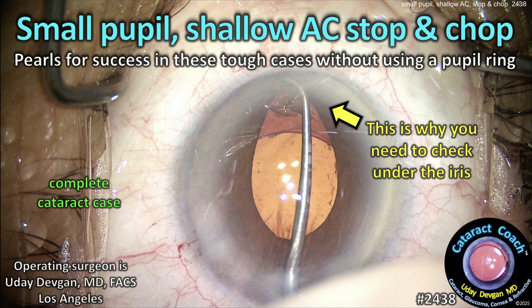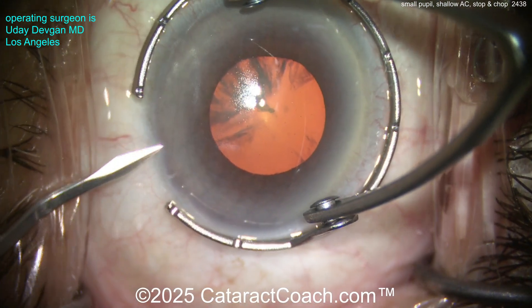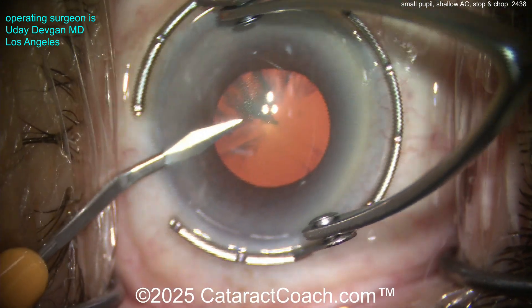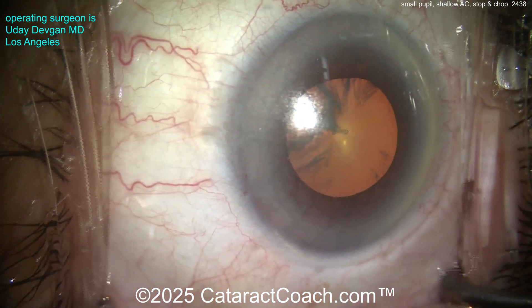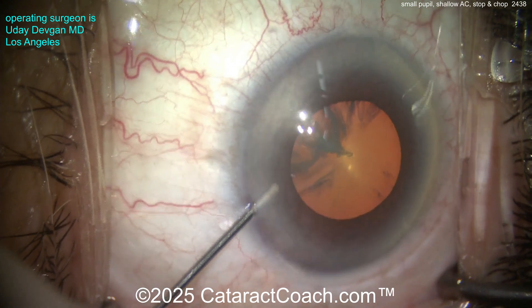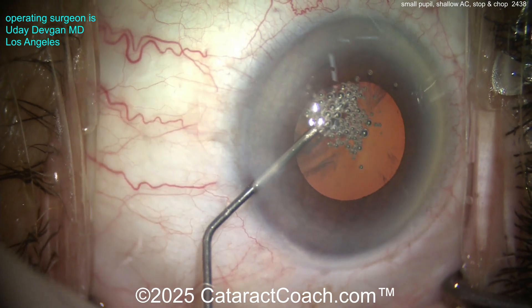CataractCoach.com — small pupil, shallow AC, stop and chop case: pearls for success in these tough cases without using a pupil ring. This is a complete cataract case. If you go to the CataractCoach website, one of the subcategories under the complete list of all videos is called 'complete cataract cases' — those are cases where I'm the only surgeon operating.